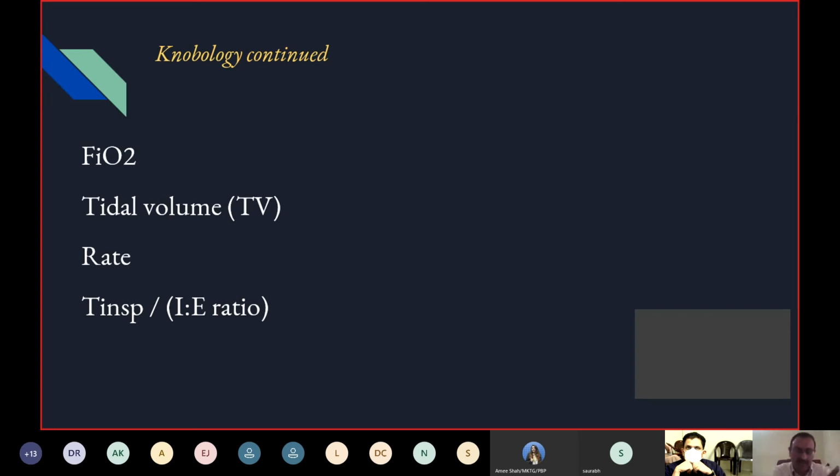Where you prolong the inspiratory time is when you need oxygenation, when you need more oxygen. You are on a high FiO2, things are not doing that great, the patient is probably having ARDS, then you sort of alter the IE ratio. Books say maybe up to 2:1. The problem you will have with 2:1 is expiration will be a problem, carbon dioxide elimination will be a problem, but then allowing a little bit of hypercapnia, as long as the pH is decent. When I say decent, I believe in a pH of more than 7.2. Some people say 7.1. As long as it's like that, probably I can alter the IE ratio a little bit in those cases.